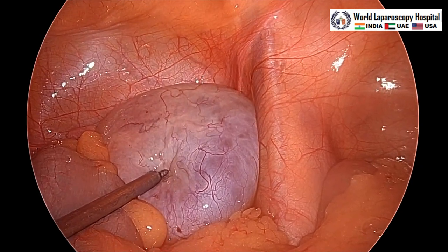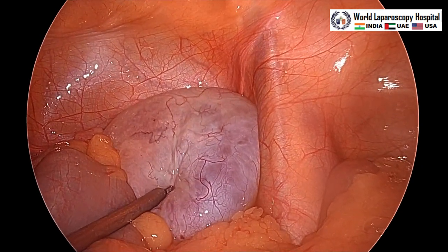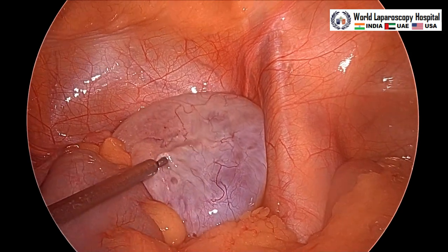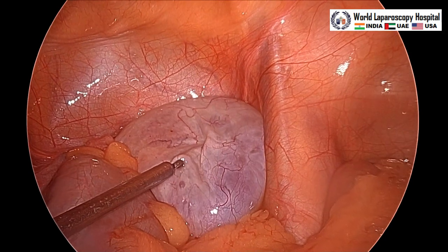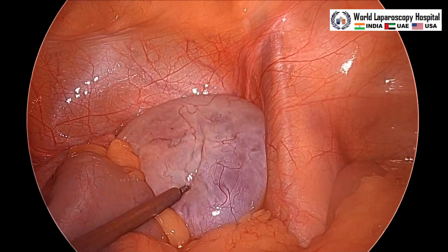We can see the cyst is deflating and the suction is attached with the aspiration needle, and all the fluid of the ovarian cyst is sucked out.